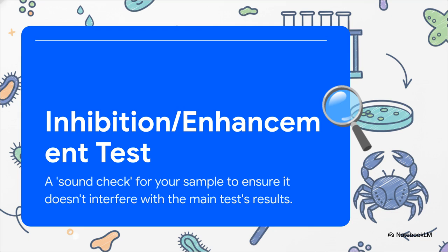A sound engineer at a concert, they have to stop two main things, right? Muffled instruments that you can't hear, and that awful high-pitched feedback screech. It is exactly the same principle here. We have to check if our sample is inhibiting or muffling the endotoxin signal we're trying to find, or if it's enhancing it, creating that false feedback. This test just makes sure the stage is perfectly set for an accurate result.